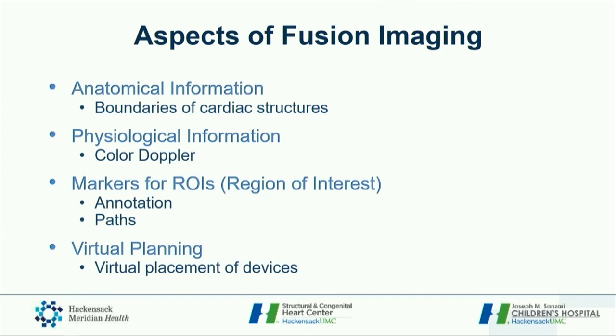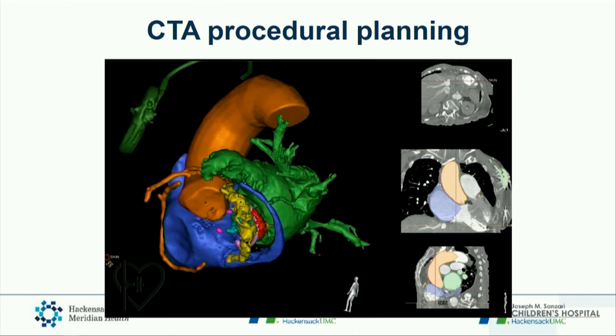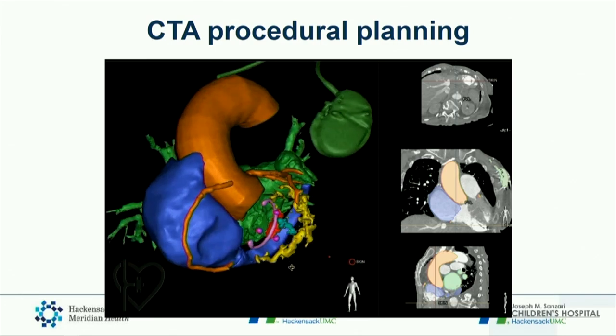The same thing applies to understanding where you can place your virtual devices. As Dr. Calverte was showing, you can create STL files of devices and superimpose them on your live fluoroscopy. So you can understand where you want to place your devices and how it looks after your procedures.